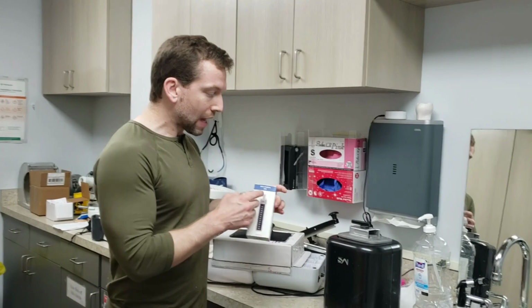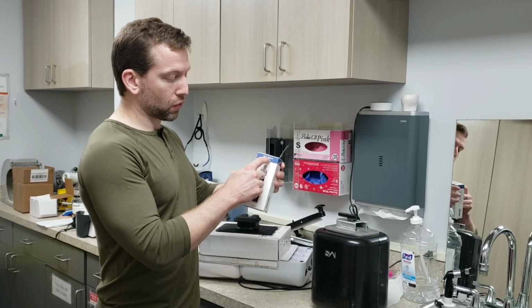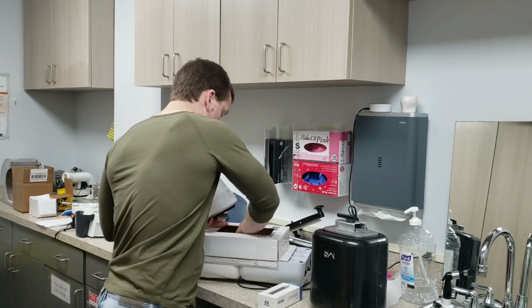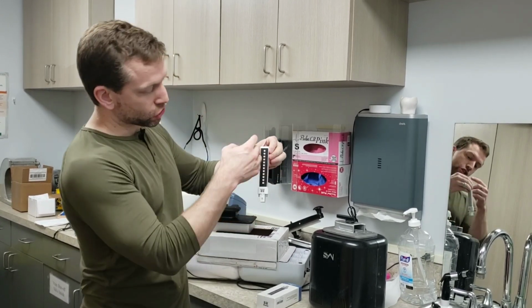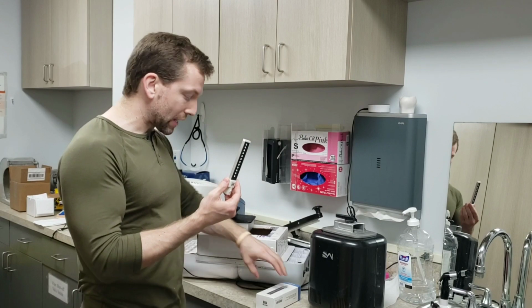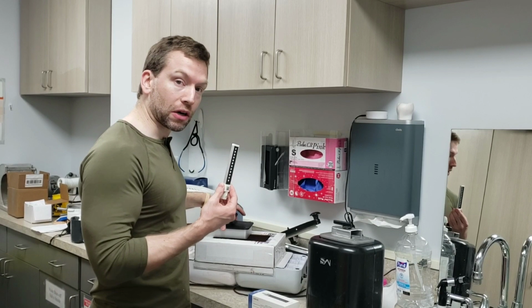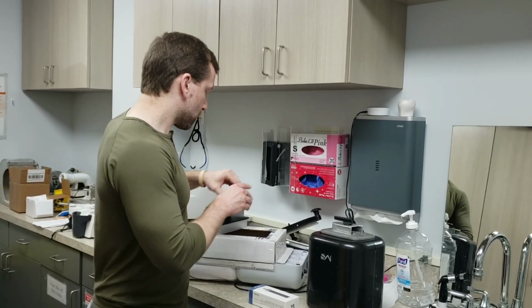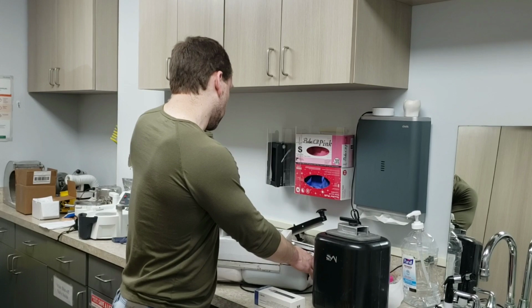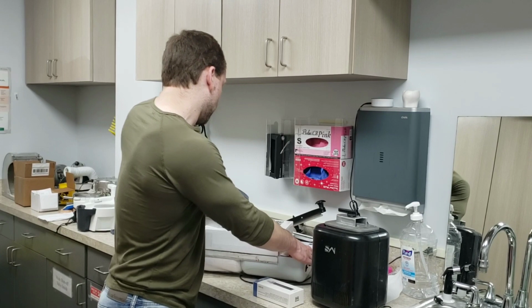One note, I replaced the light bulbs with these, okay? They are actually 365 by 405 nanometer LED lights. So let me just pull one out. And this is what they look like. It's a strip of LED lights, okay? And we're wanting the 405 nanometer light wavelength, okay? So these should last longer. They should provide more consistent light, so you're not worried about, is my light going bad, and not realizing I'm not getting the intensity I want. Plus, it's giving you that wavelength you want. So all the above: longer lasting, more consistency, and the proper wavelength.